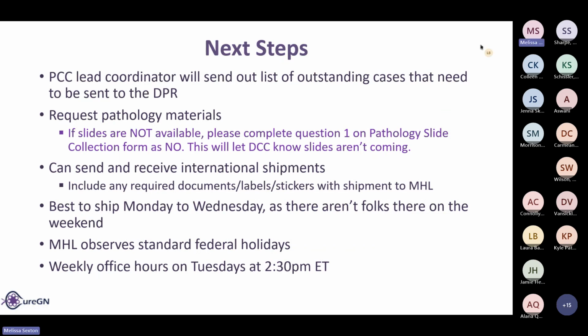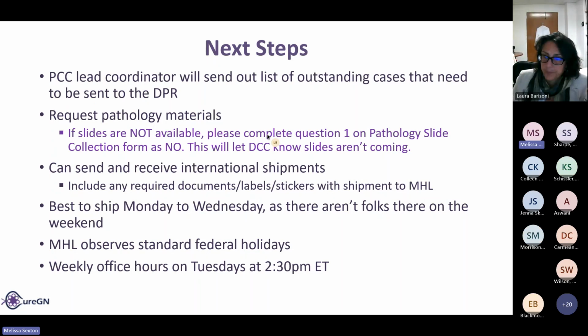When they scan slides, do we separate them by subject? Sorry, an email or a chat question. Yes. So when you pull the manifest to help you put everything into the box, the order they are in the box needs to match what's in the manifest. So you want to make sure those are generally grouped by subject, and then they're numerical within that subject.